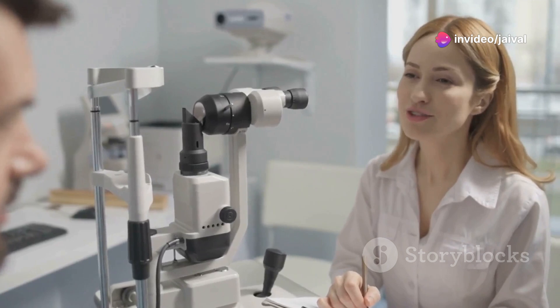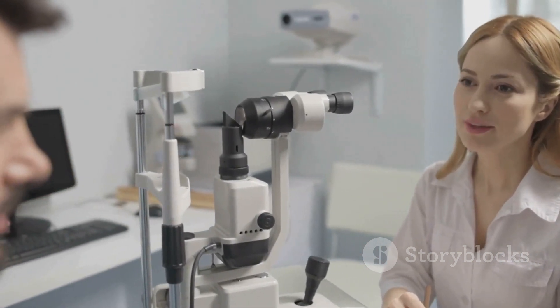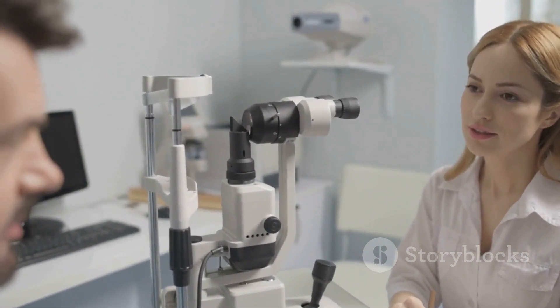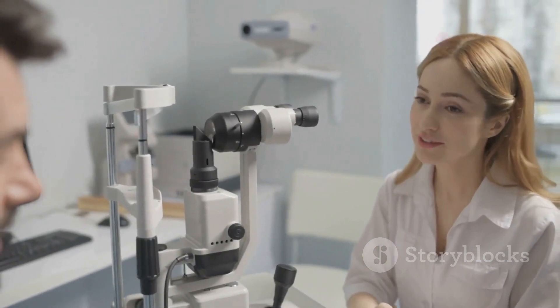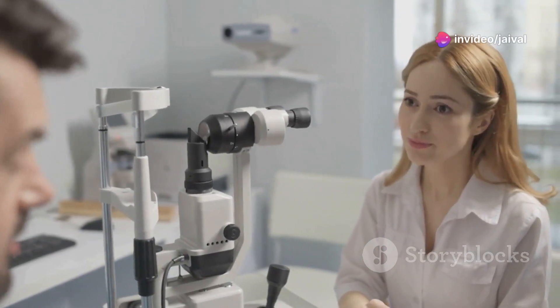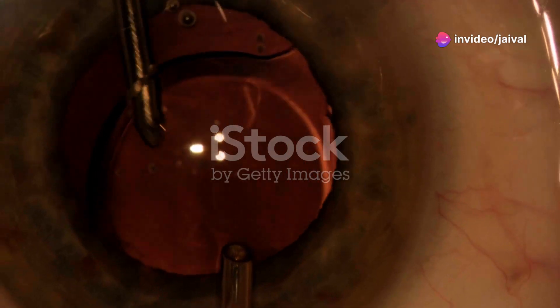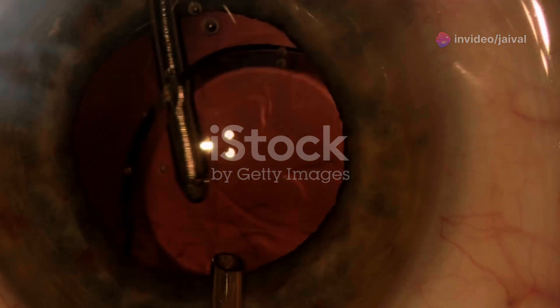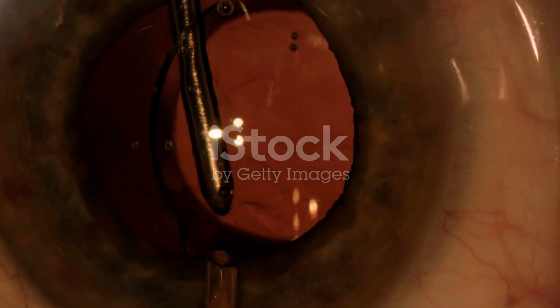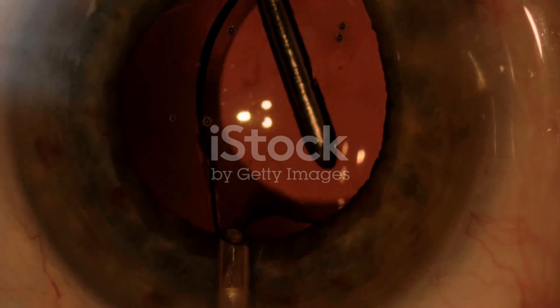Gonioscopy is a specialized examination technique in ophthalmology. It is a critical procedure that allows eye care professionals to gain a detailed view of the anterior chamber angle of the eye, which is not visible through routine examination methods. It allows visualization of the iridocorneal angle, a vital area where the iris meets the cornea. This angle is essential for the proper functioning of the eye's drainage system.